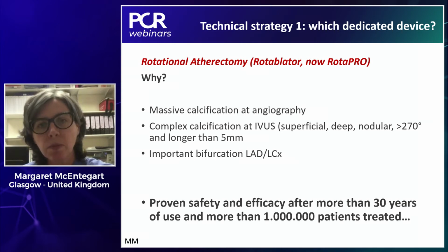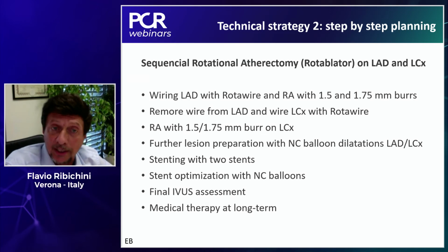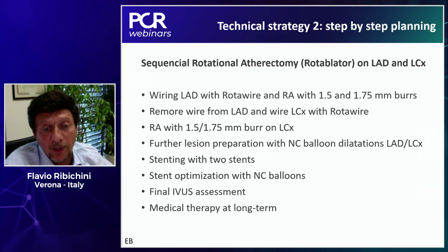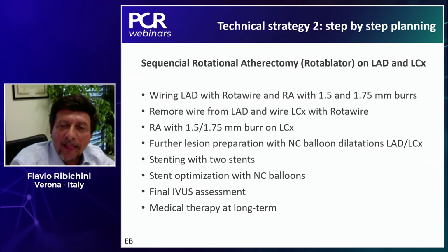Yeah, this is an important point. Sometimes the device is perceived as being demanding and sometimes a little bit risky, but it's exactly the contrary. Once you are confident with this technology, it's the most tested and proved technology ever used in calcified lesions. And this is true. Millions of patients treated, decades of experience. And so it's a very well-validated technique. Of course, you need to learn how to use it. And this is why we are here.